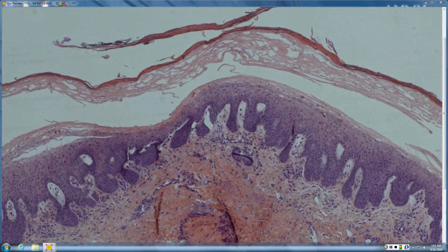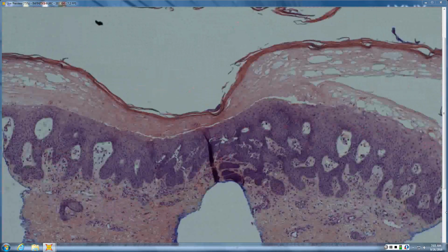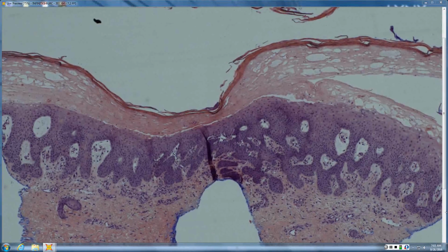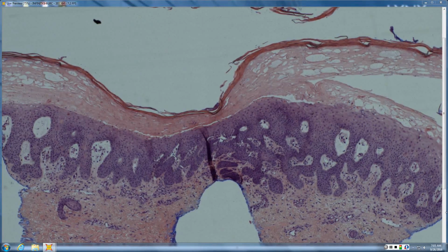So this is nutritional deficiency dermatitis. Now, this is actually a really good slide of it. As Elston says in his book, unfortunately, it's not usually this classic. So when you guys are getting an inpatient consult and that crosses your mind, which is one of the many reasons why dermatology is so valuable, because it does not cross the mind of many other people. But you have to think of those nutritional deficiencies, not just acrodermatitis enteropathica, so zinc, but biotin and essential fatty acids and all these other things can create a very similar dermatitis.